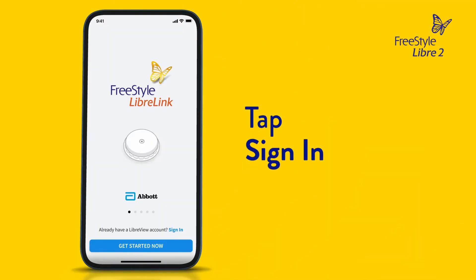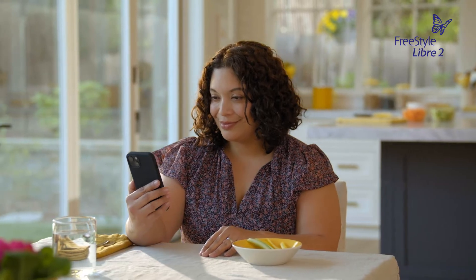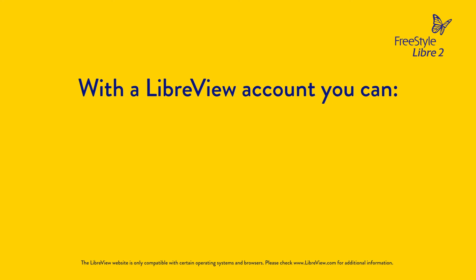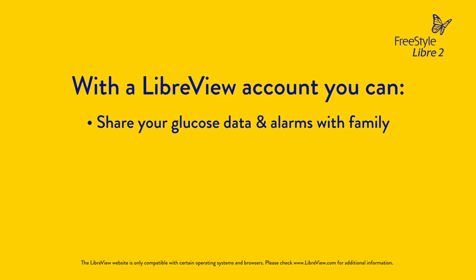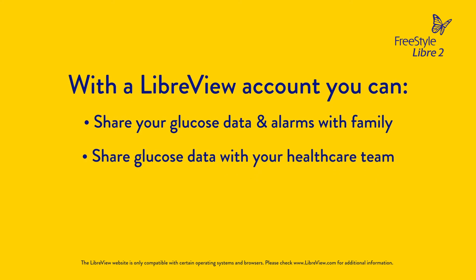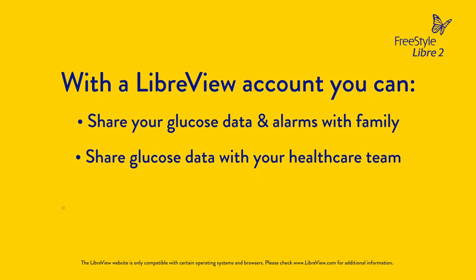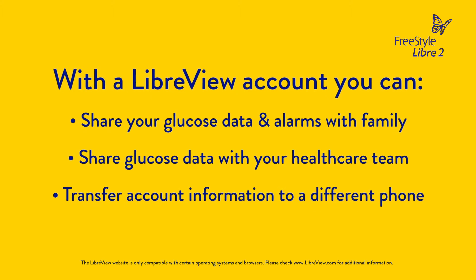If you already have a LibreView account, tap Sign In, or you can create one right in the app. You may have a LibreView account if you have used the Freestyle LibreLink app in the past. We recommend you create a LibreView account so that you can share your glucose data and alarms with family, and share your glucose data with your doctor and healthcare team so they can view it remotely.